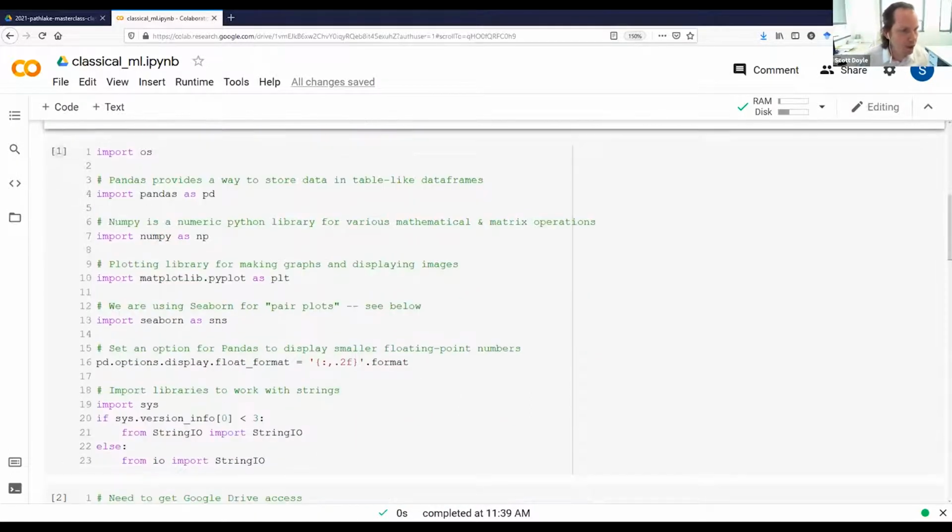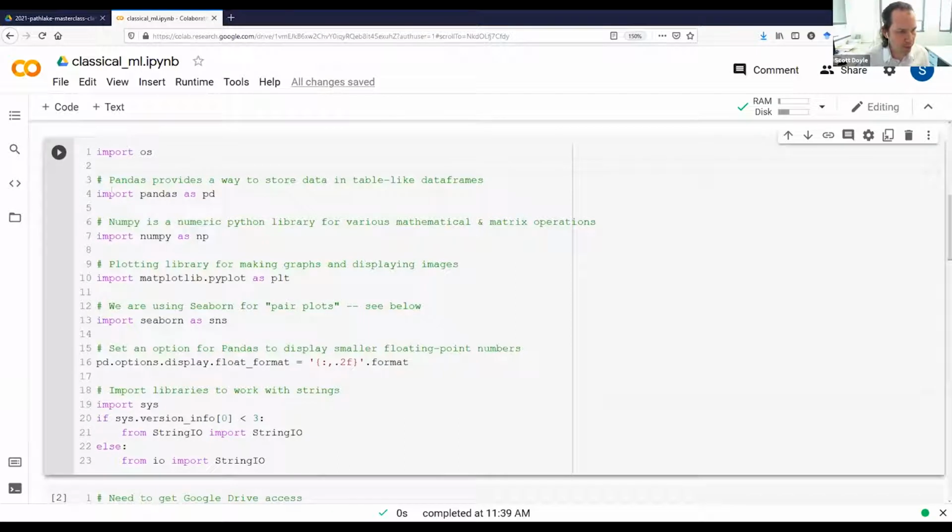So to use this code, we have a bunch of statements here that import these modules, and we give them useful names or aliases. Don't worry too much about this. It's just a series of different import steps that's going to allow us to use various functions throughout the code. So I'm going to run this.